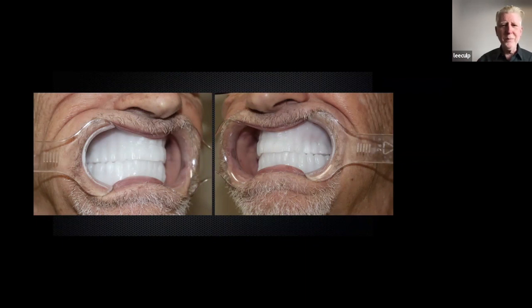Aesthetics is difficult because you can't see anything. I mean, everything is white. So I did not like that the first time we did it. We had already had some printers, and we did have some test resins for teeth and denture bases. So we did this monolithic white denture one time, and then immediately went to printing.